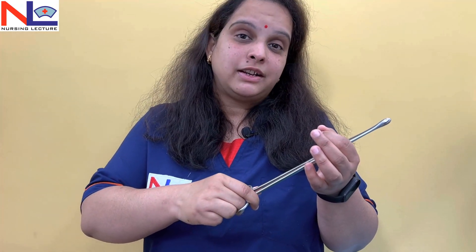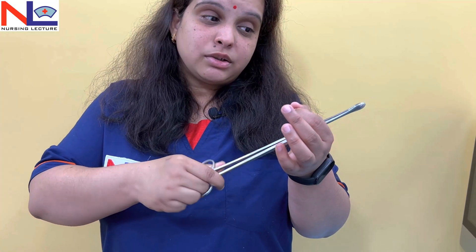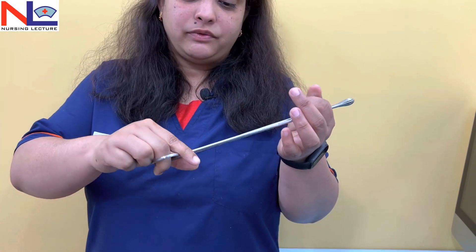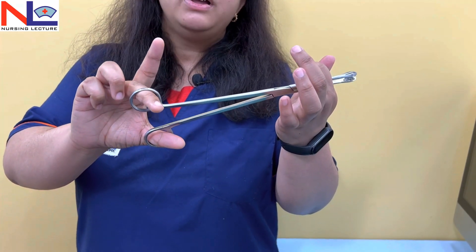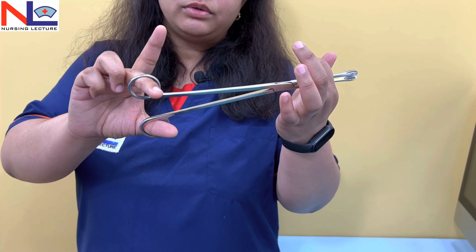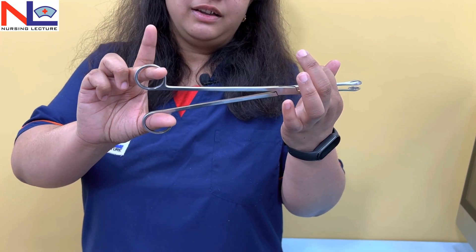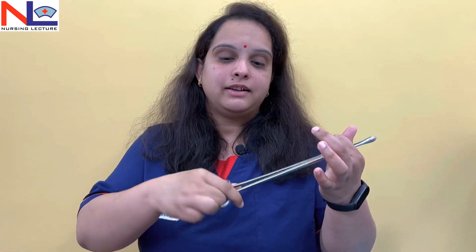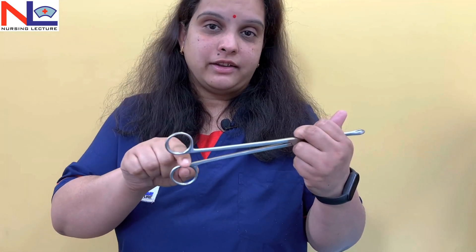Why do we use a rotatory motion? Because sometimes if the uterine wall is accidentally caught, by using rotatory motion we feel some resistance and thereby we can allow the forcep to release that resistance. That is why there is no catch. If there were a catch, it could injure the uterine wall and cause heavy bleeding. So to avoid that, there is no catch.